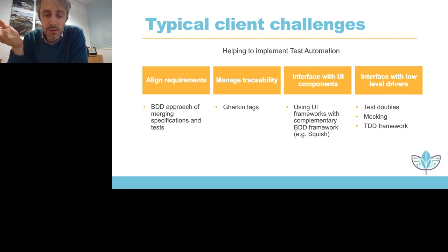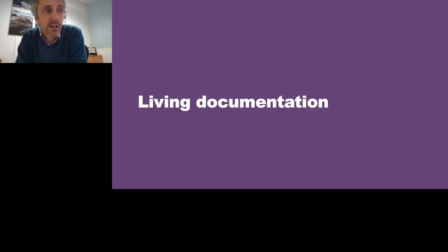Interfacing with UI components, I've already talked about, using BDD frameworks, and interfacing with low-level drivers or inputs and outputs. We've got a kind of raft of techniques that we can recommend in this area, whether it's around test doubles, mocking or custom electronics, depending how far you want to go. So that's test automation and how that helps.